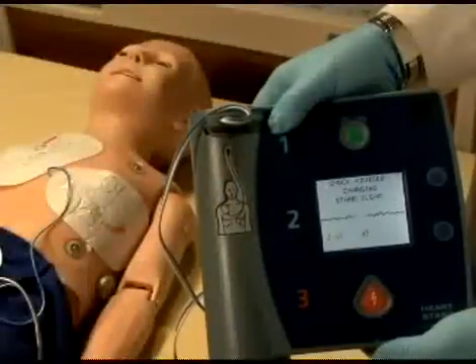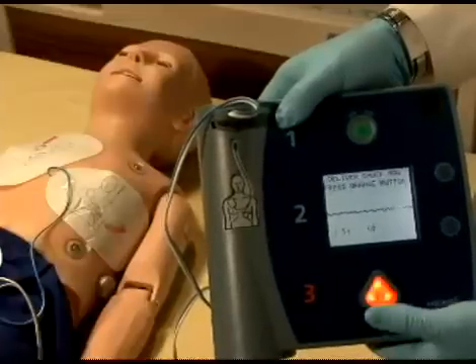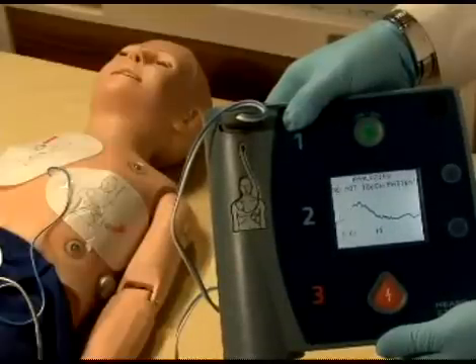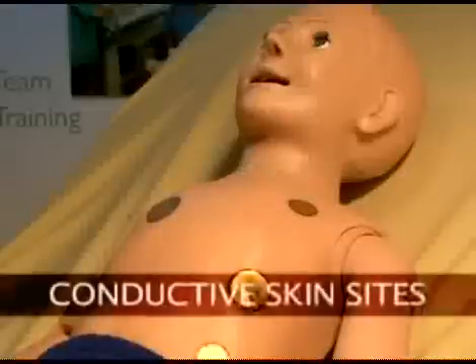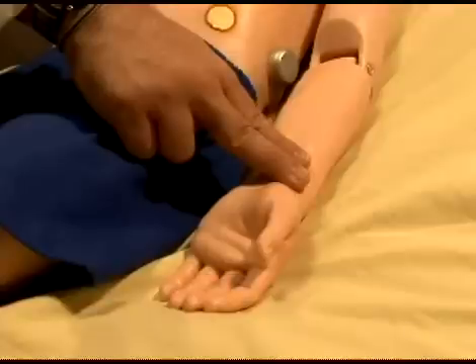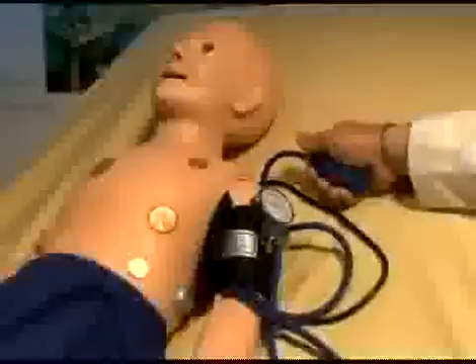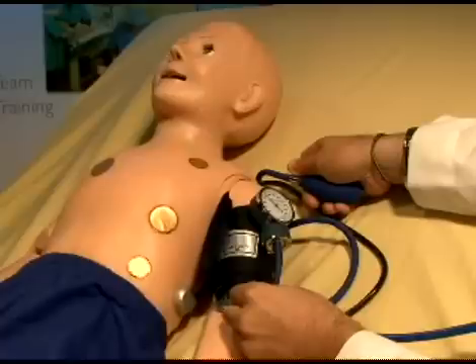An AED will display pediatric HAL's ECG, analyze cardiac rhythm, and advise action — a perfect addition to competency-based training. Pediatric HAL's conductive skin sites are conveniently placed anteriorly to allow easy access for pacing. Pediatric HAL's palpable pulses are dependent on blood pressure, and users can also disable distal pulses to simulate severe hypotension. Blood pressure can be read using a sphygmomanometer and users can auscultate the Korotkoff sounds.